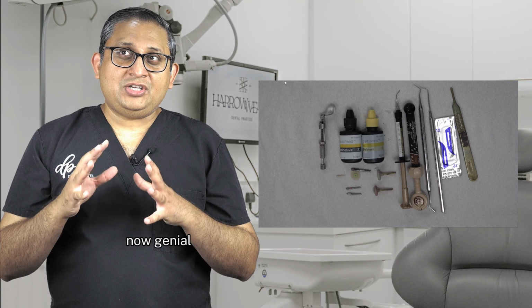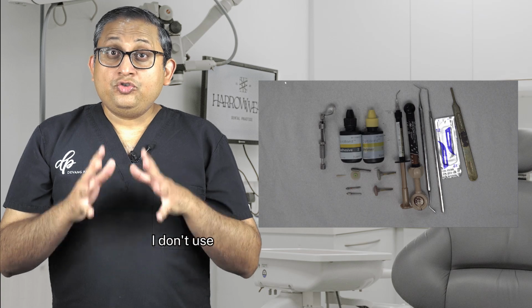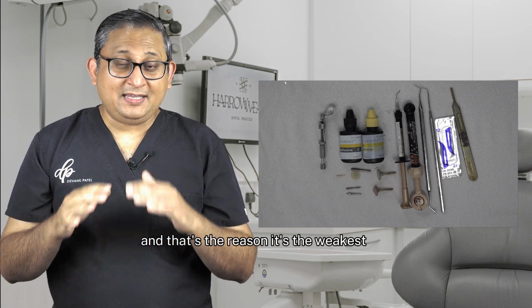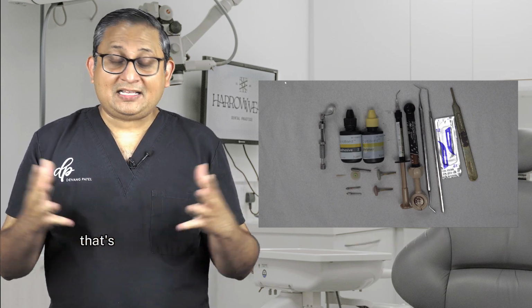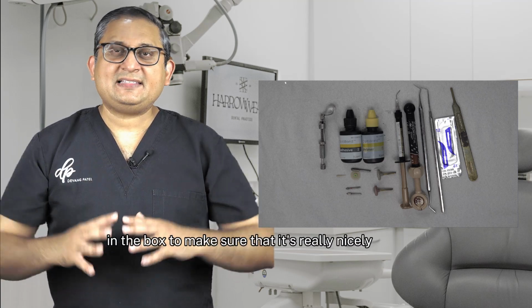Now, injectable is used to seal the margin. I don't use normal flowable composite because normal flowable composite has a much higher shrinkage rate, and that's the reason it's the weakest link, and that's why I don't use it on the base. But injectable is good, or you can use heated composite. That's what I was using before injectable even came. So you can use heated composite in the box to make sure that it's really nicely adapted.